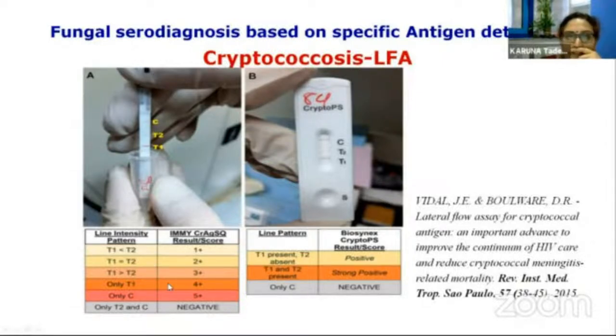So these are some of the lateral flow assay based techniques where you don't require any sample treatment. It is very easy. You just add the sample on the sample pad and you get the results.